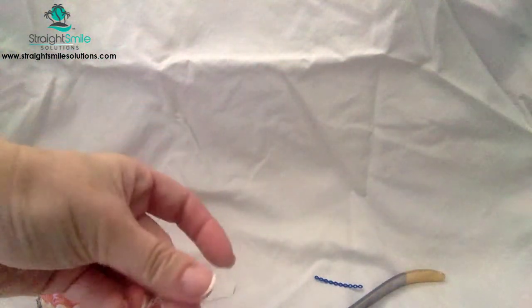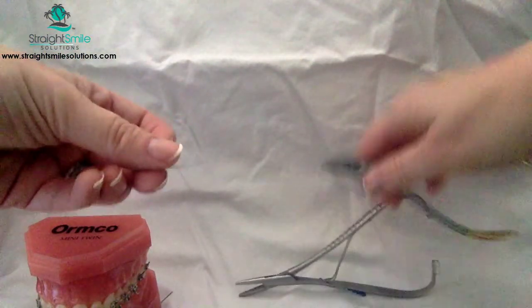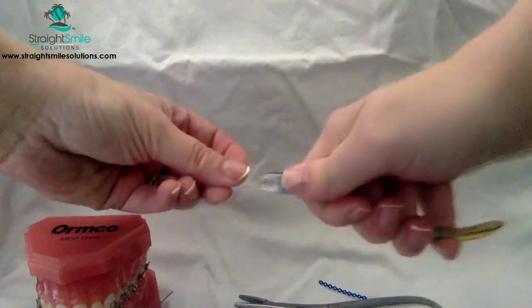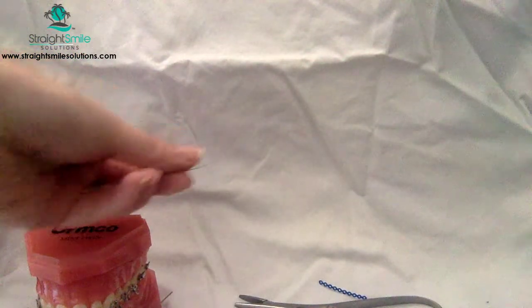Okay, can you see that? That's a little bit long there, my cinch. That's way long. That would be poking the patient. But we cinched it, right? And you can run it under cold water to anneal it a little better. And then you can just go ahead and clip. That's still a little bit long, but you get the idea. And then you put it in the patient's mouth and tie it.